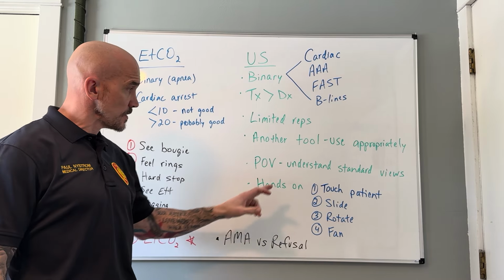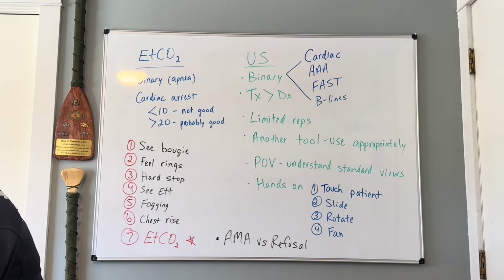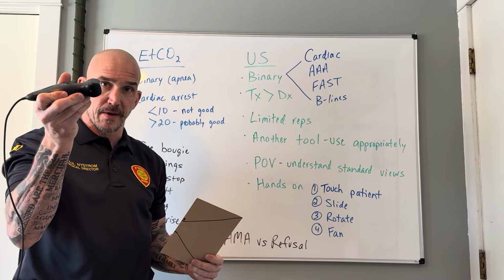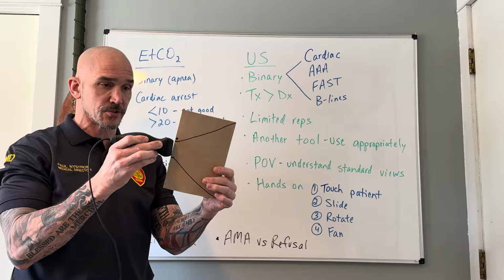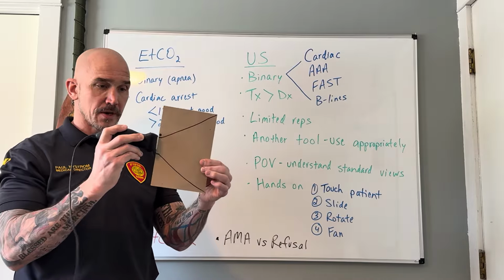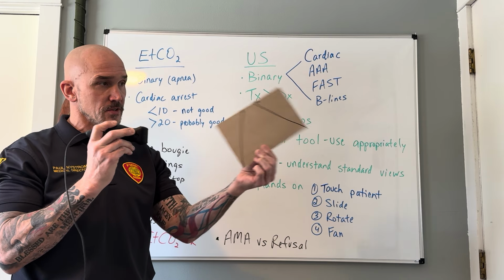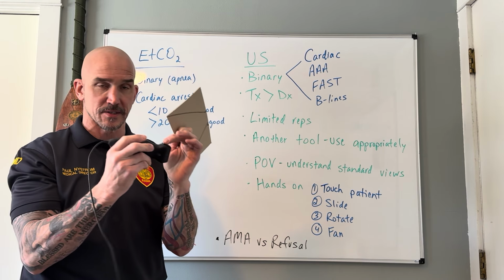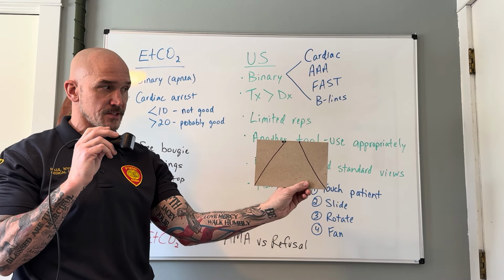So in terms of the hands-on, some pointers. We've talked about this. There's my marker dot to the top of my probe. This is what I'm seeing on the screen, right? I'm not seeing the point of view from the ultrasound like this. I'm seeing the screen, and even though the screen is over here, and depending on which way it's oriented, where my marker dot is corresponds to the marker dot here, that's what I see on the screen.